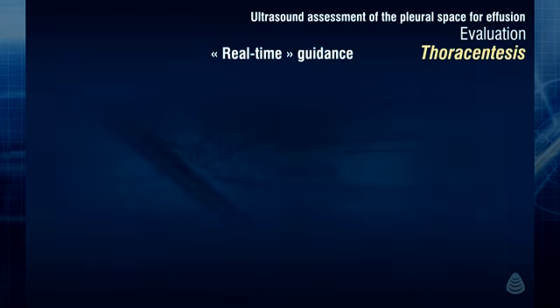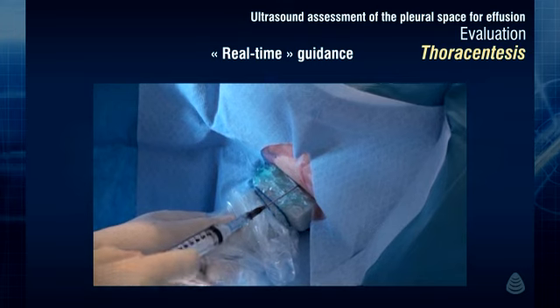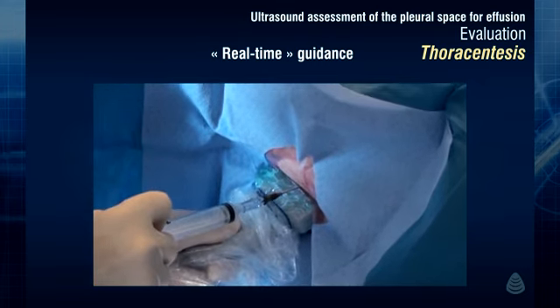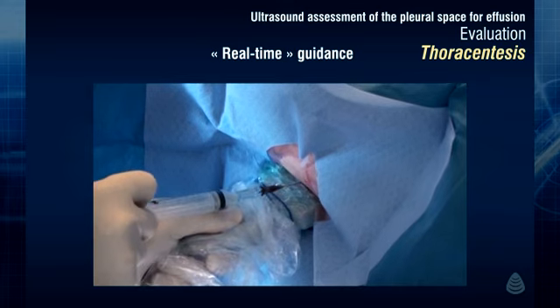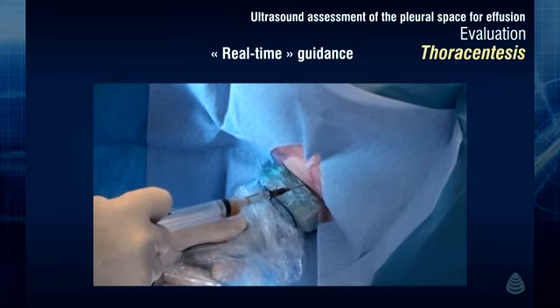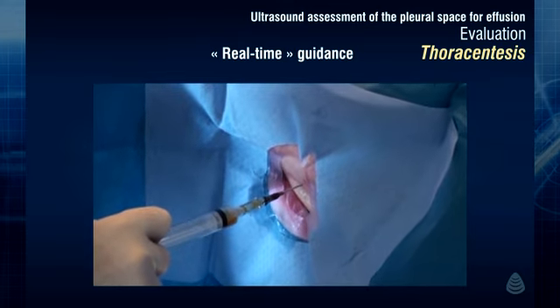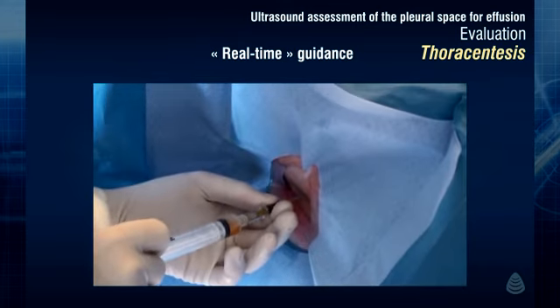A prior complete assessment of the effusion has to be performed with the phased array or curved linear array probe before proceeding with the ultrasound-guided thoracentesis with the linear probe. Use of the linear array probe will allow the needle insertion in the fluid collection to be well visualized during the procedure. The transverse or longitudinal view may be used depending on the operator's preference and the space available. The transverse approach is here demonstrated.